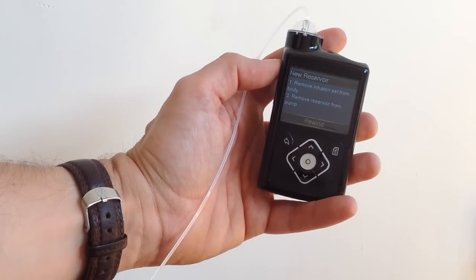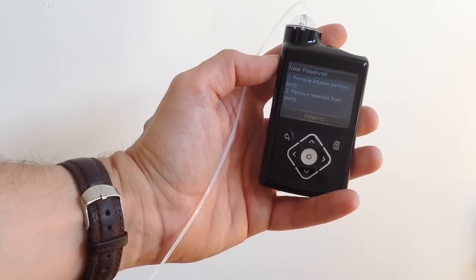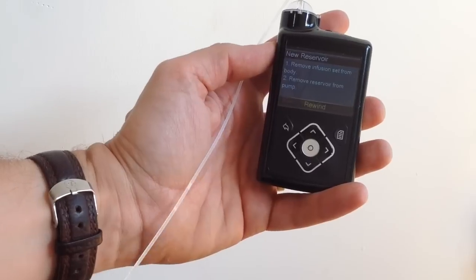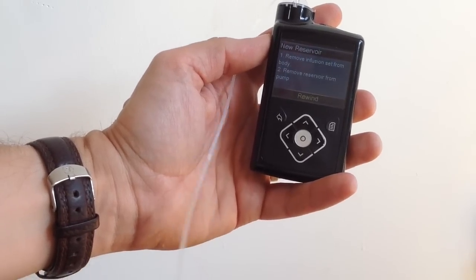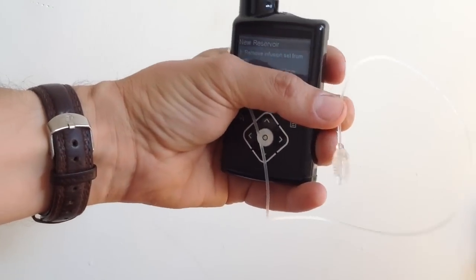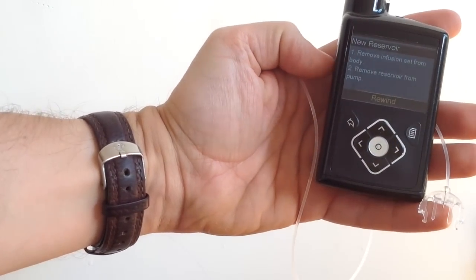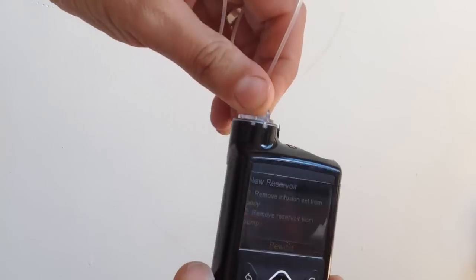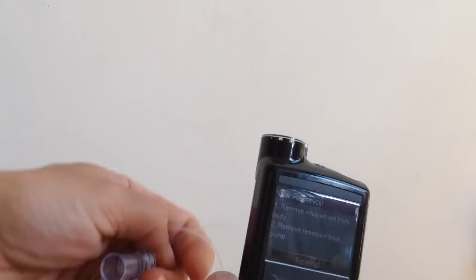And then it just gives you this little piece of text to remind you what to do. So first of all, you remove the infusion set from the body, you disconnect that, and there we are, there's the end. And then you remove the reservoir from the pump, which just slots at the top there.